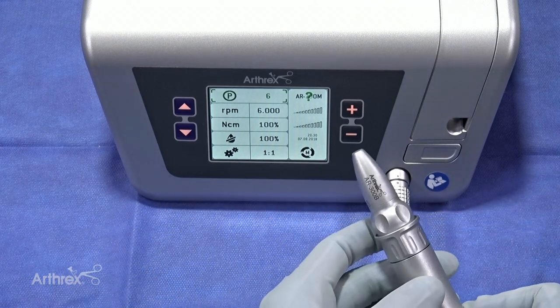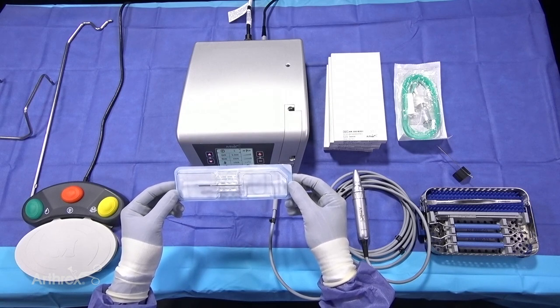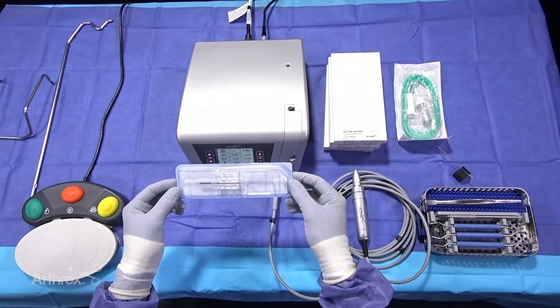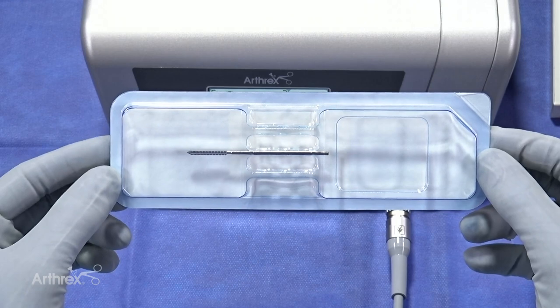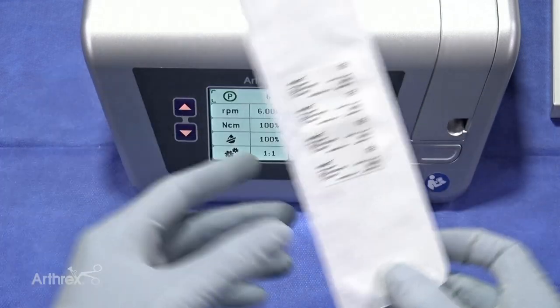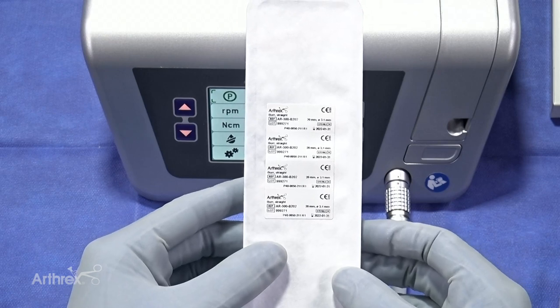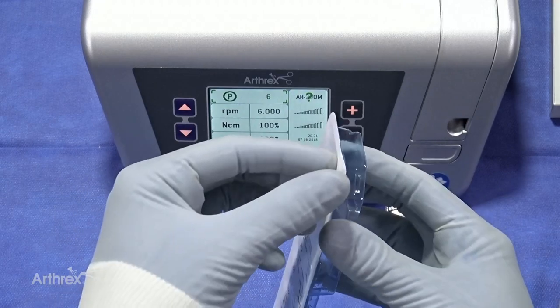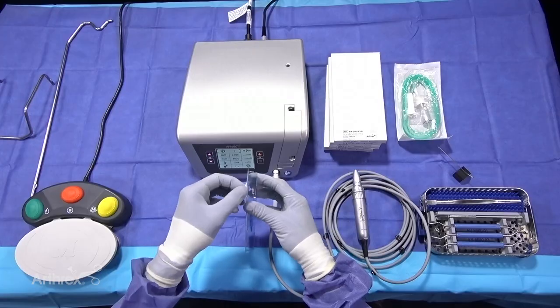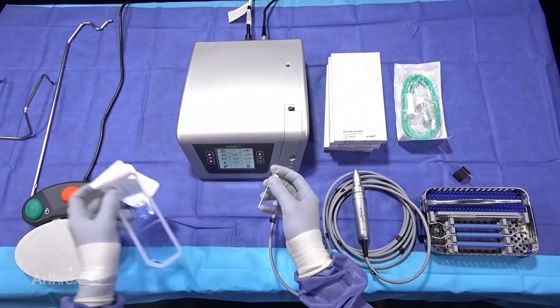Now we're ready to attach our burr. Arthrex offers various options of burrs specific to the procedures you'll be performing for minimally invasive surgery. This specific burr is for the calcaneal osteotomy — a 3 millimeter by 20 millimeter working length burr. These are all single-use sterile packed in a white box as simple peel packs. I'll pull it out and now we're ready to attach the burr.